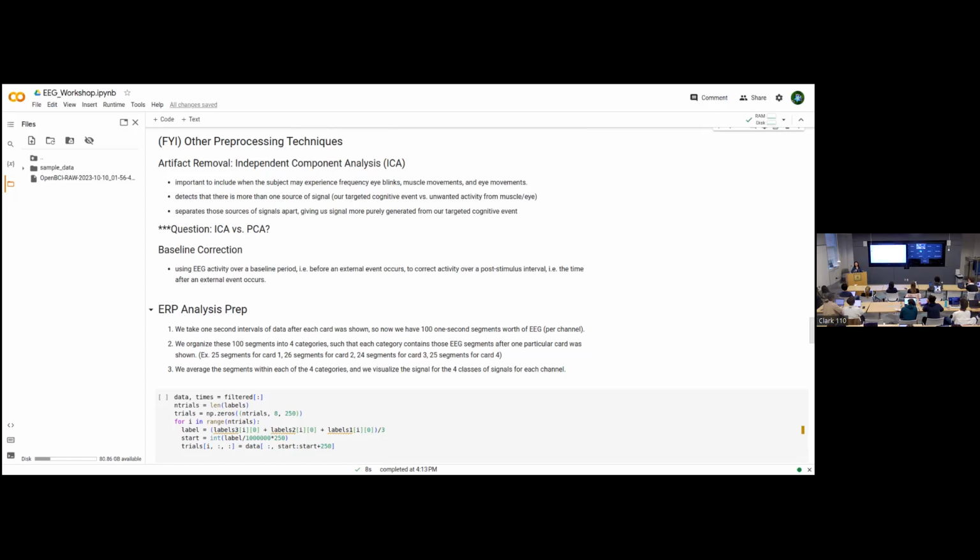But the issue with applying that to EEG data is that EEG data doesn't have that orthogonal component. So you cannot assume it can be separated into the most principal components, because you might lose information when you neglect the later components that contribute less of the variance.